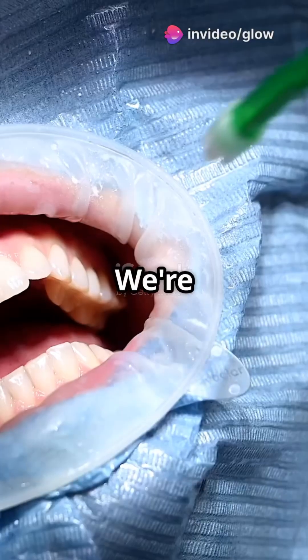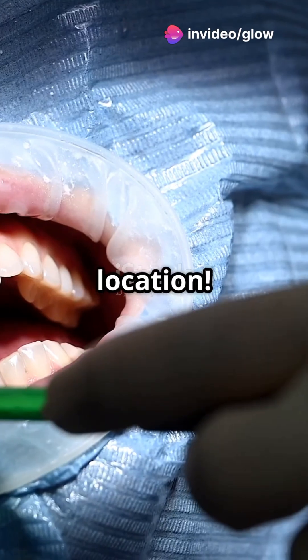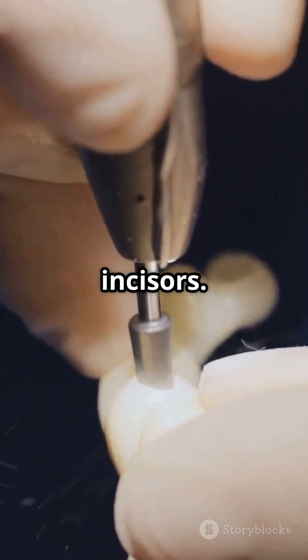Hold on to your dental mirrors folks, we're diving into the nitty-gritty of class 1 cavity prep. First up, location. We're talking about the chewing surfaces of molars and premolars, and sometimes the lingual pits of maxillary incisors.